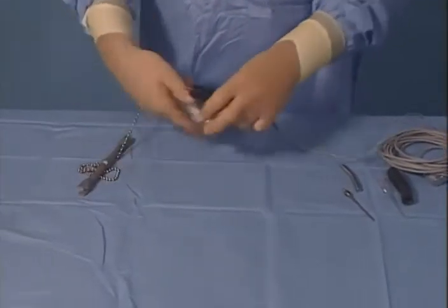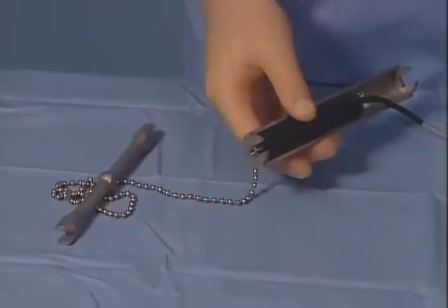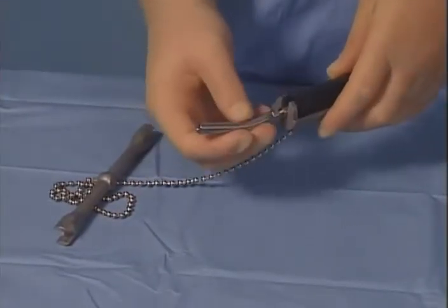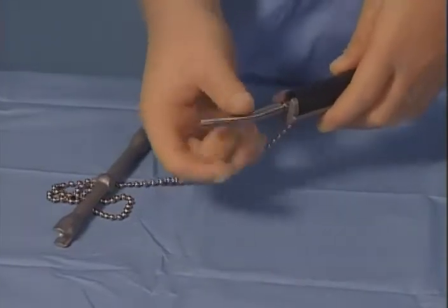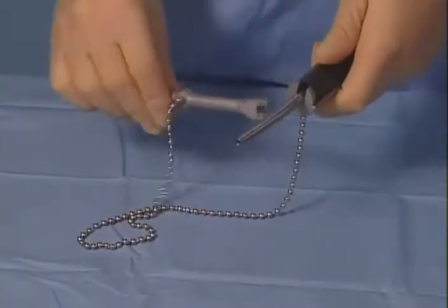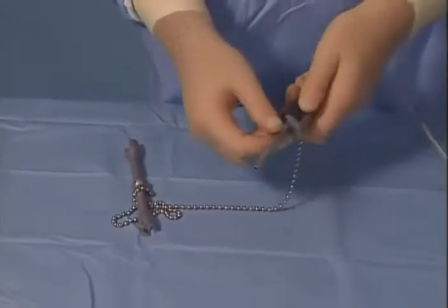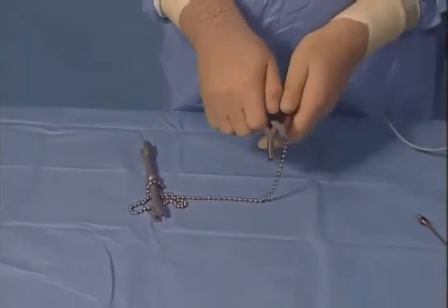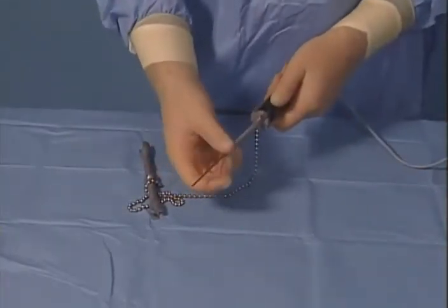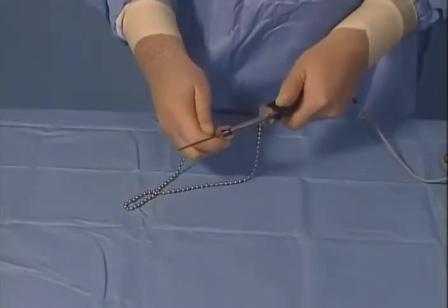Using the appropriate wrench set, place flat 2 of the handpiece and secure in the appropriate sized slot of the holder. Screw the silver angled extension into the handle by hand, and then tighten it in a clockwise direction with the spanner. Reposition the handle of the handpiece securing flat 1 into the appropriate sized slot of the holder. Screw the tip into the angled extension by hand, and then, using the spanner, tighten the tip by turning the spanner clockwise.